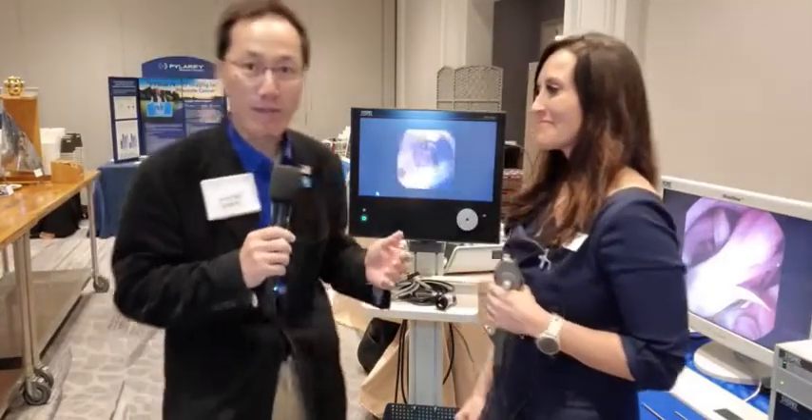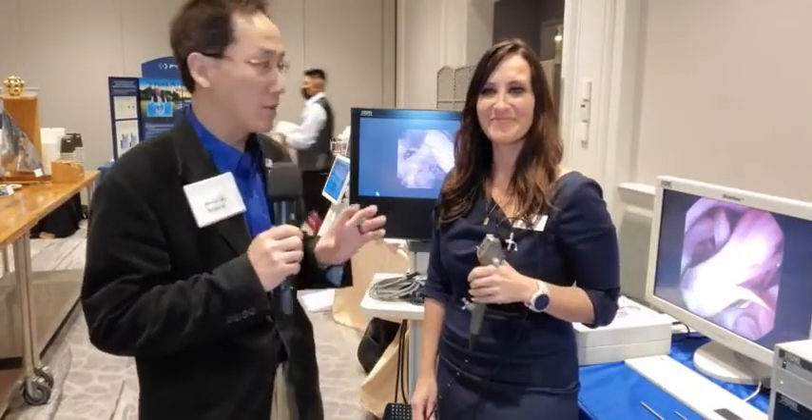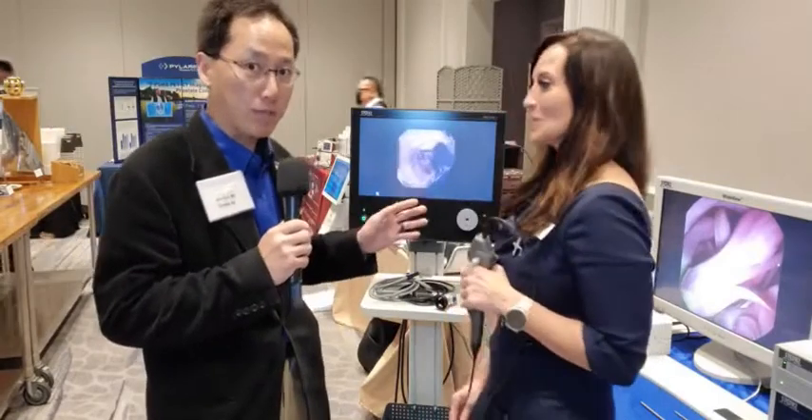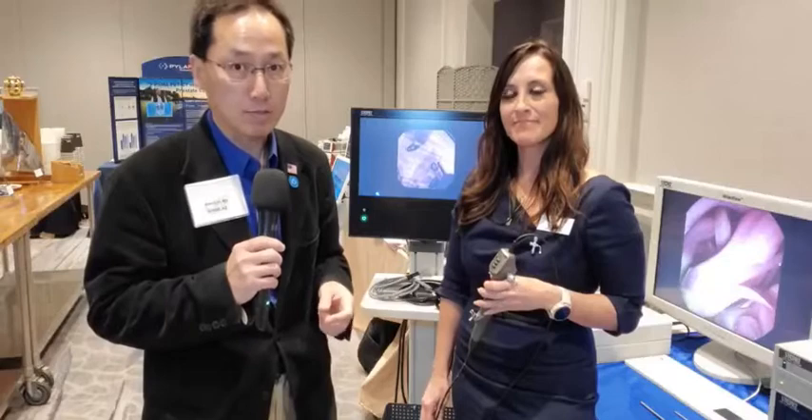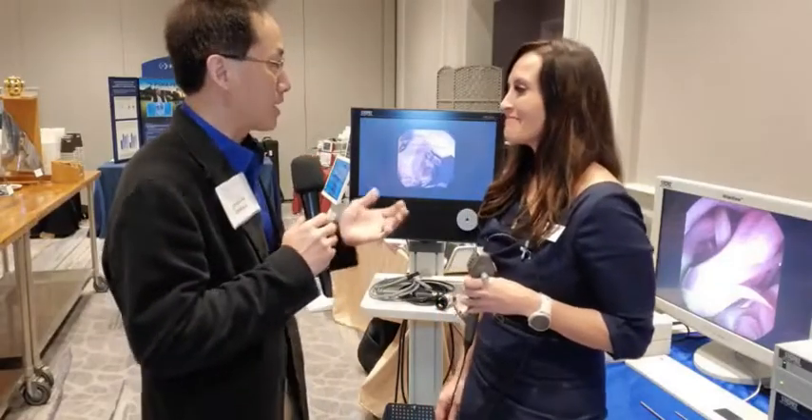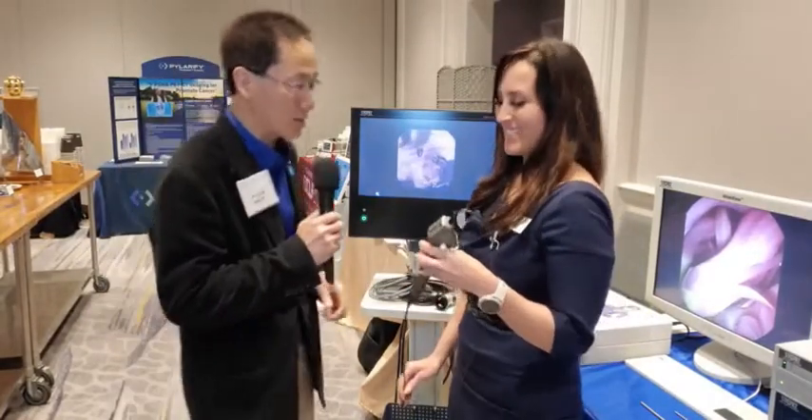Just because you can't be here doesn't mean you have to miss out on the latest and greatest. I'm here at the 47th annual UCLA state-of-the-art urology review course at the exhibitors booth. I have Catherine here from Stortz — she has an updated version of their Telepack, called the Telepack Plus, which may be applicable to those looking for a video tower solution for in-office cystoscopy. Catherine, give us a little update on what's going on with Stortz and this Telepack.